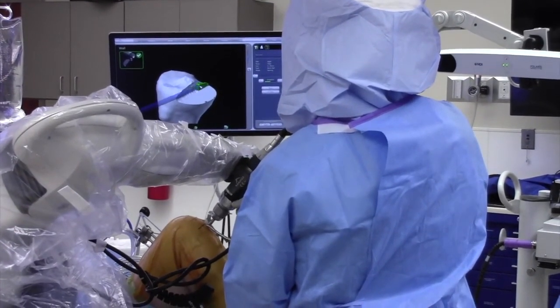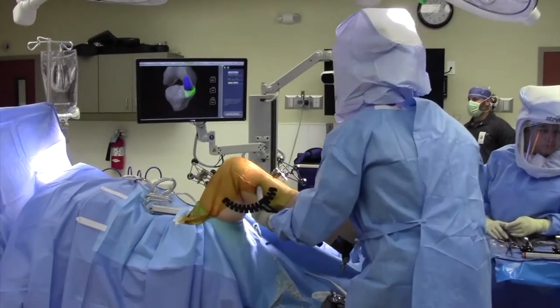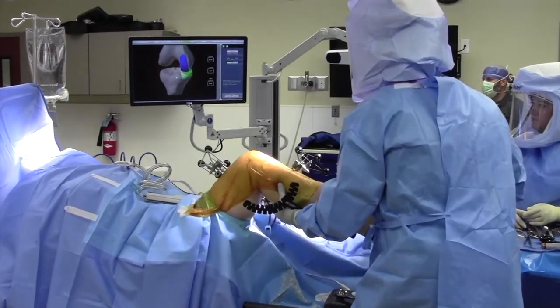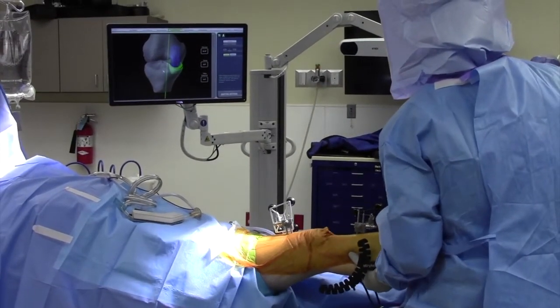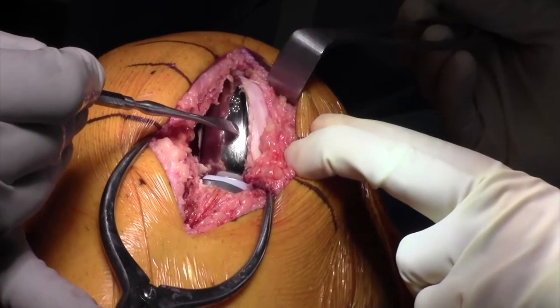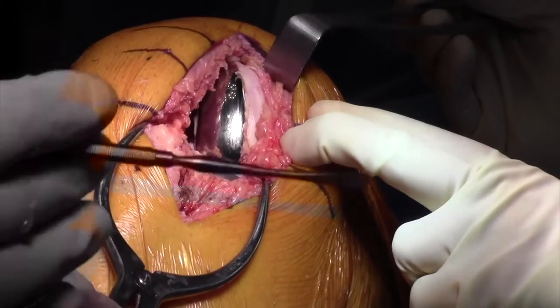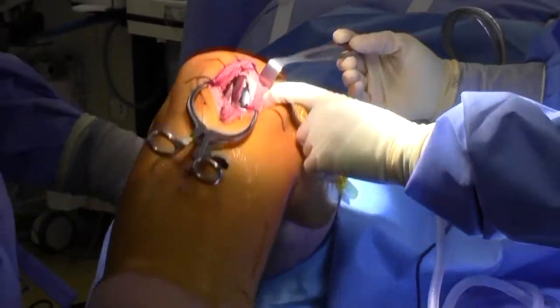Once our cuts are complete, we will ensure that the ligament balance is perfect by placing trial implants and taking the knee through a range of motion. Here with the final implants in place, you can see that the metal is perfectly aligned with the healthy cartilage and that our ligament balance is normal.